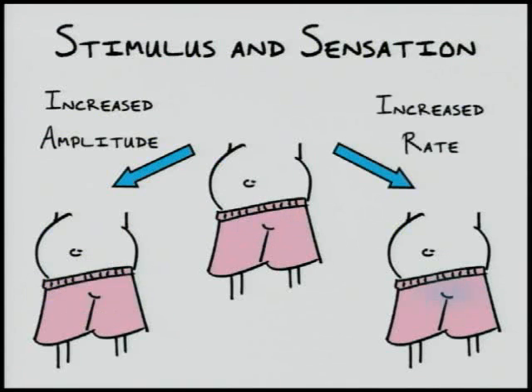Increasing the rate of the stimulus will cause patients to have a change in sensation from a thumping at a low stimulus rate to a fluttering at a higher stimulus rate.